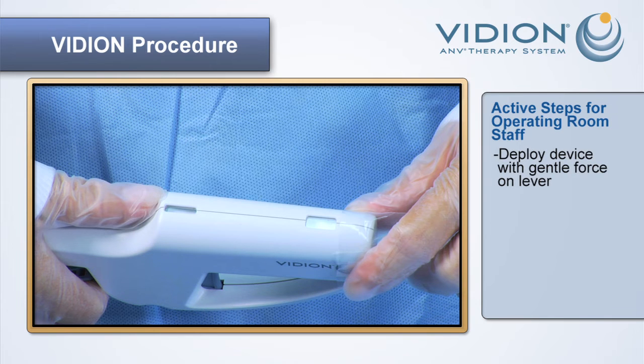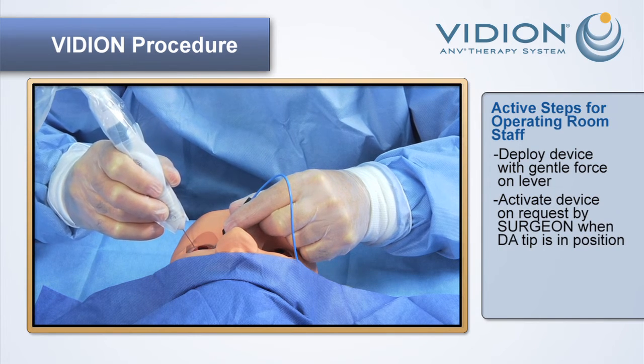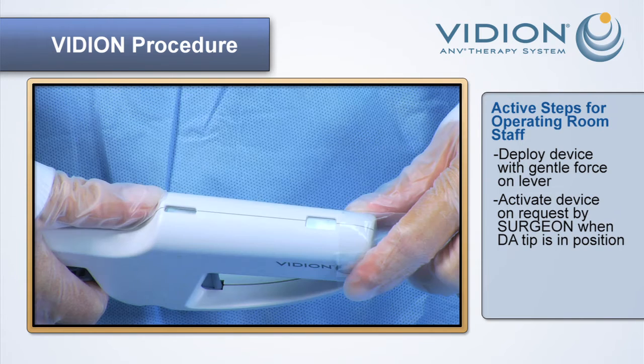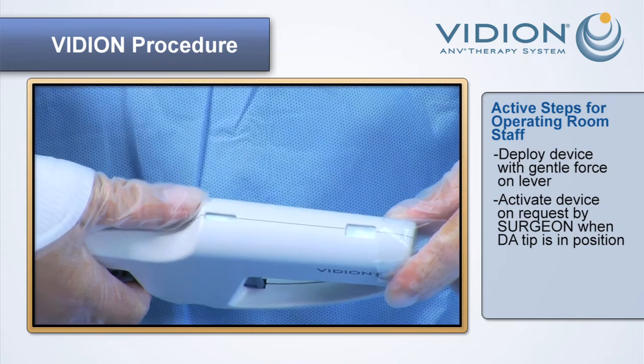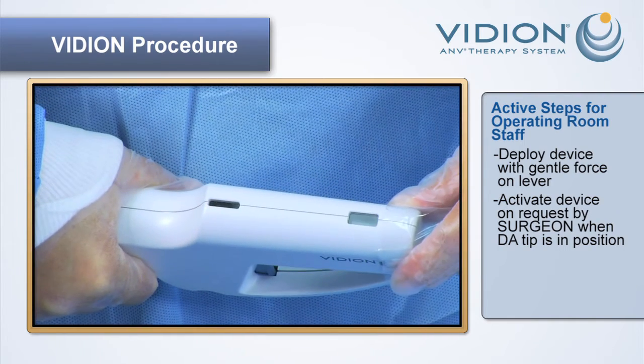Activate the device with gentle and consistent force. Depress the lever to deploy the device. When the retinal surgeon indicates that the disposable applicator tip is in the mid-vitreous position, the scrub nurse, on request by the retinal surgeon, will actuate the advancement lever on the handheld cable actuator. The advancement lever will lock into place.